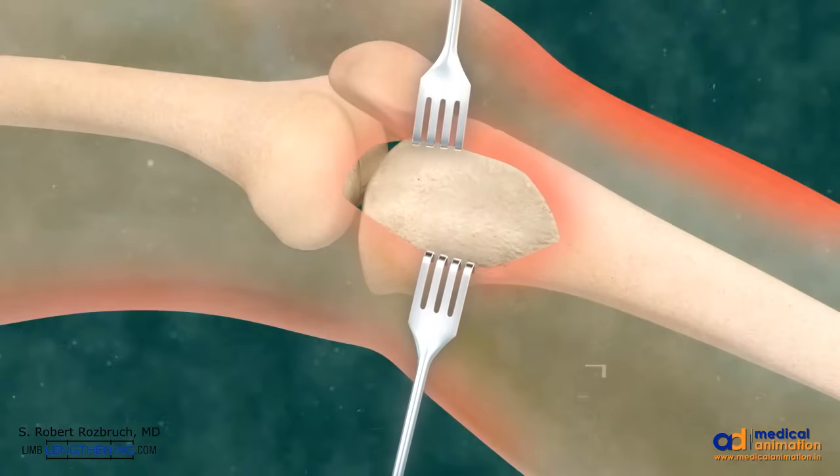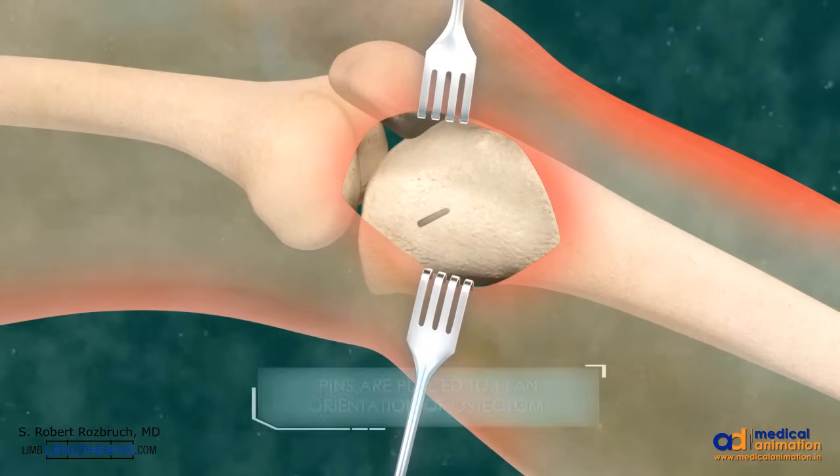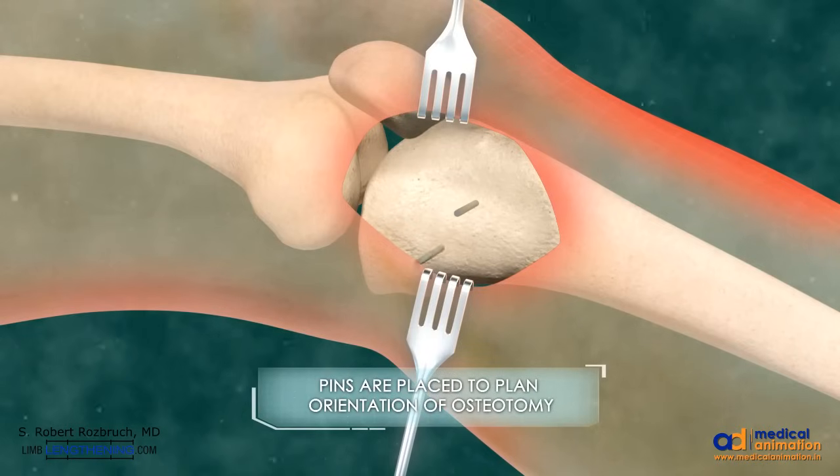Soft tissue is dissected down to the bone. Guide wires are inserted to plan the orientation of the osteotomy.